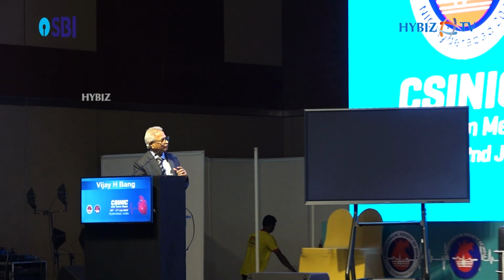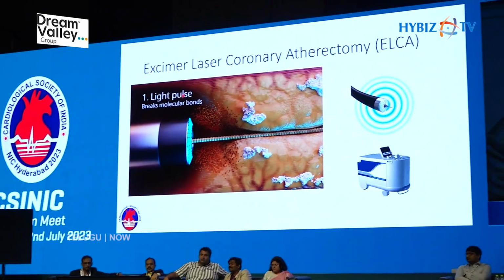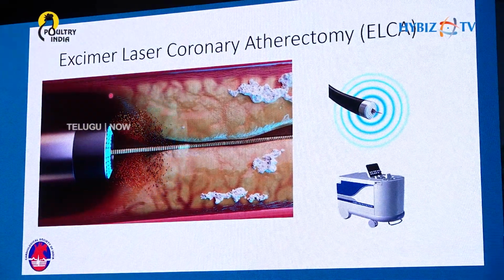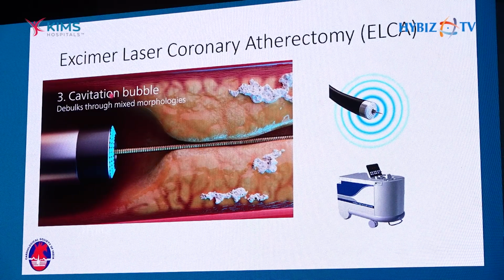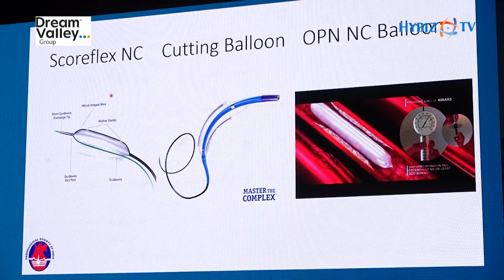Now coming to the laser, we all know laser is a new technology. How it works is a very unique threefold action. One is the light, which breaks the molecular bond. Second is a sonic pulse, which modifies the vessel compliance. And third is the bubble, which is very effective in debulking the morphology of the calcium. So this is the advantage with laser. And then of course, we are aware of the Scoreflex, cutting balloon and OPN.